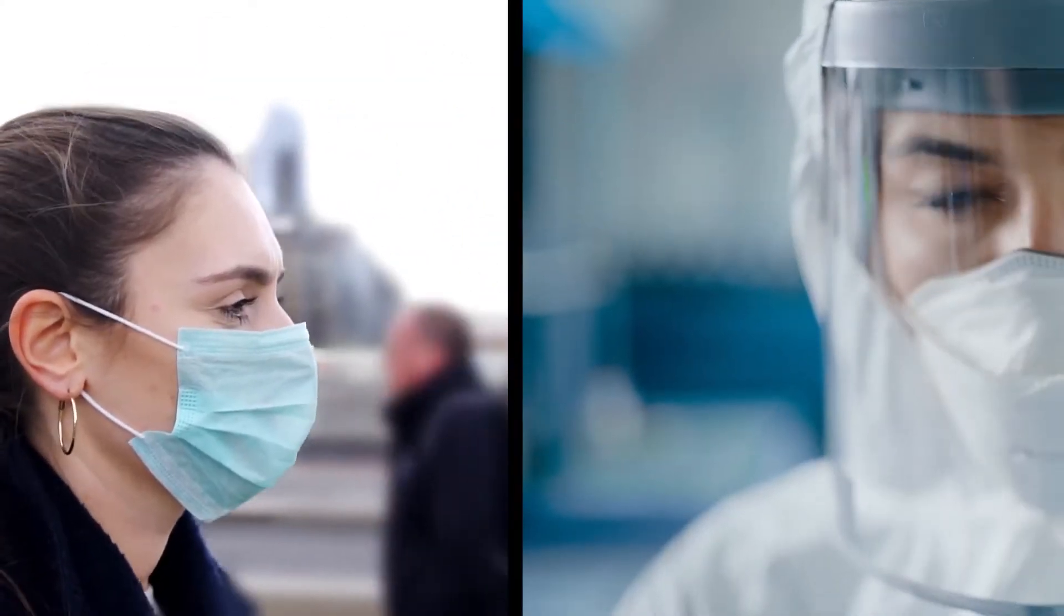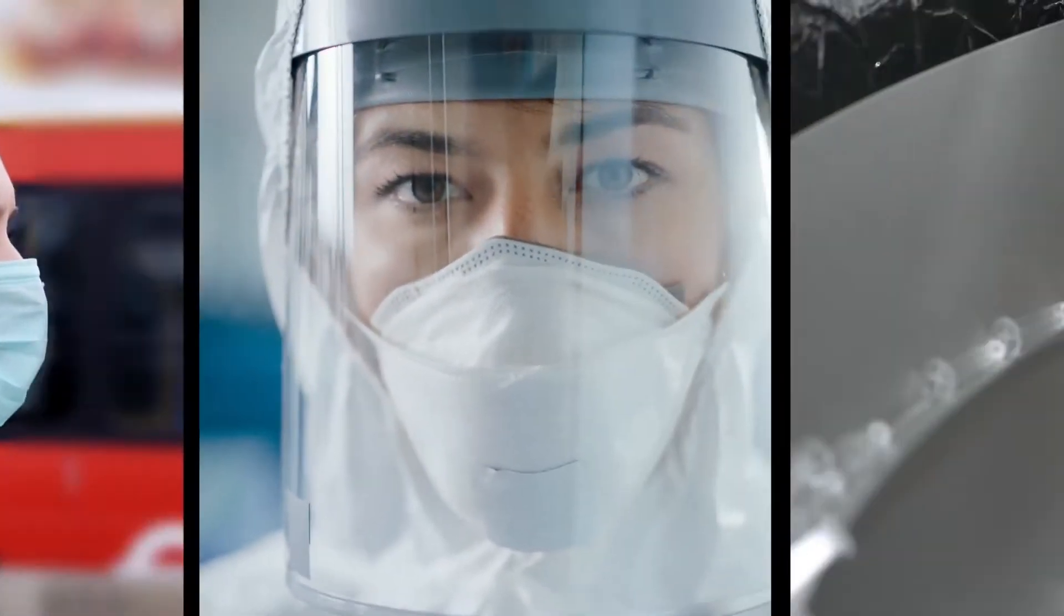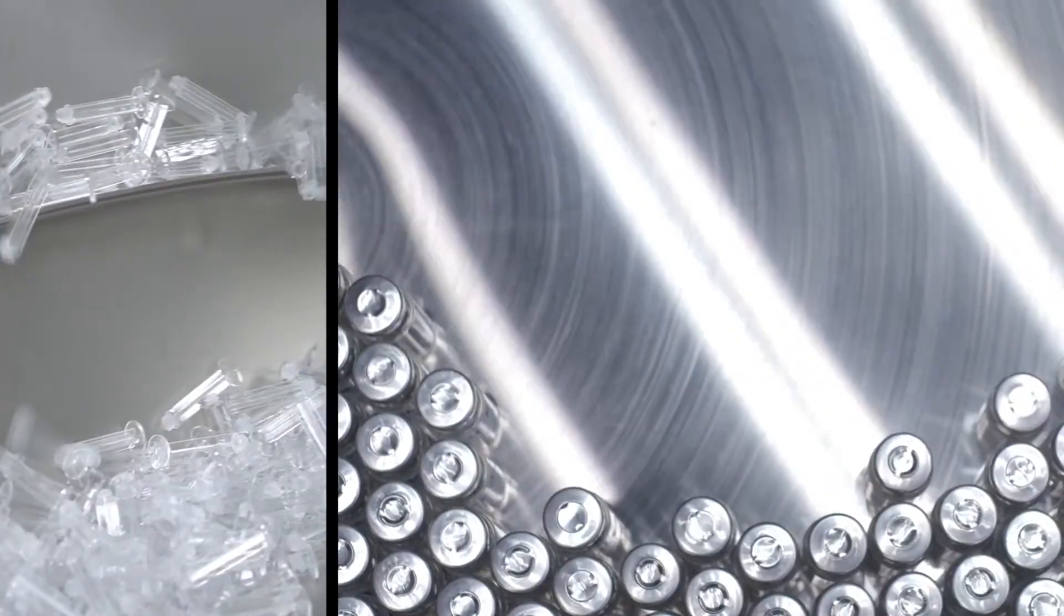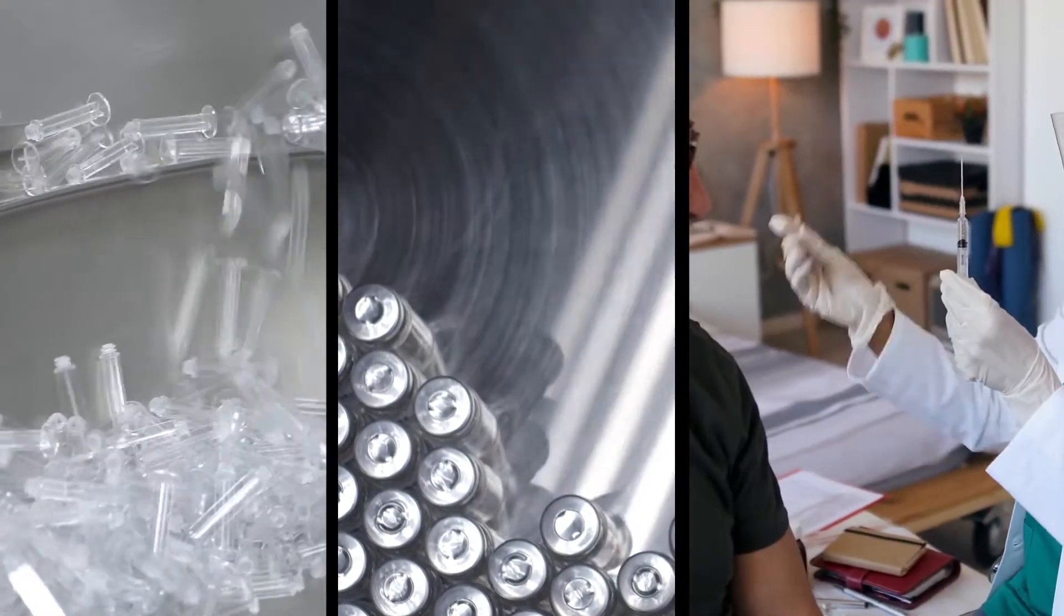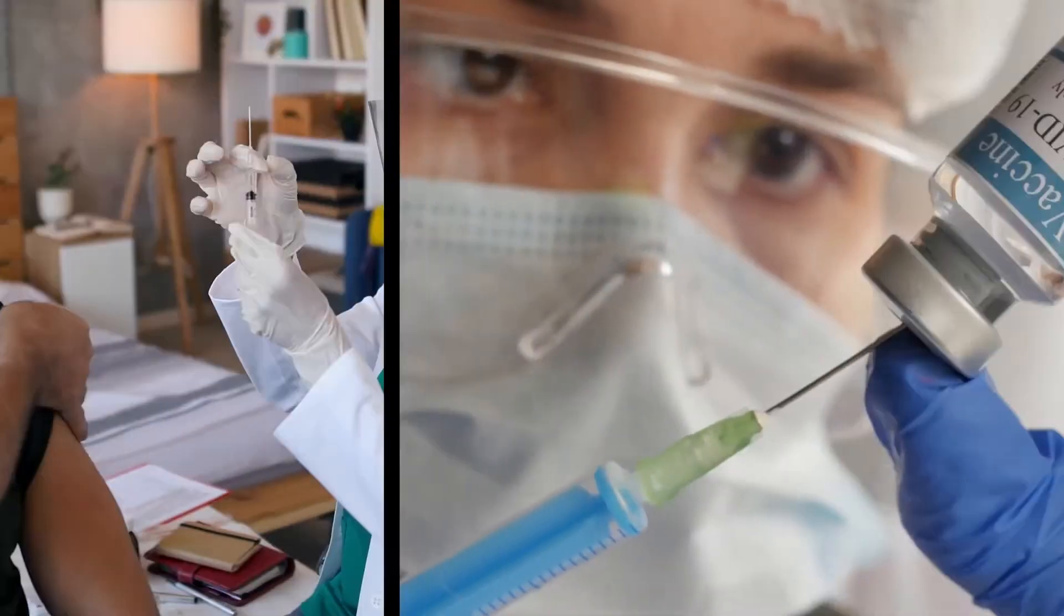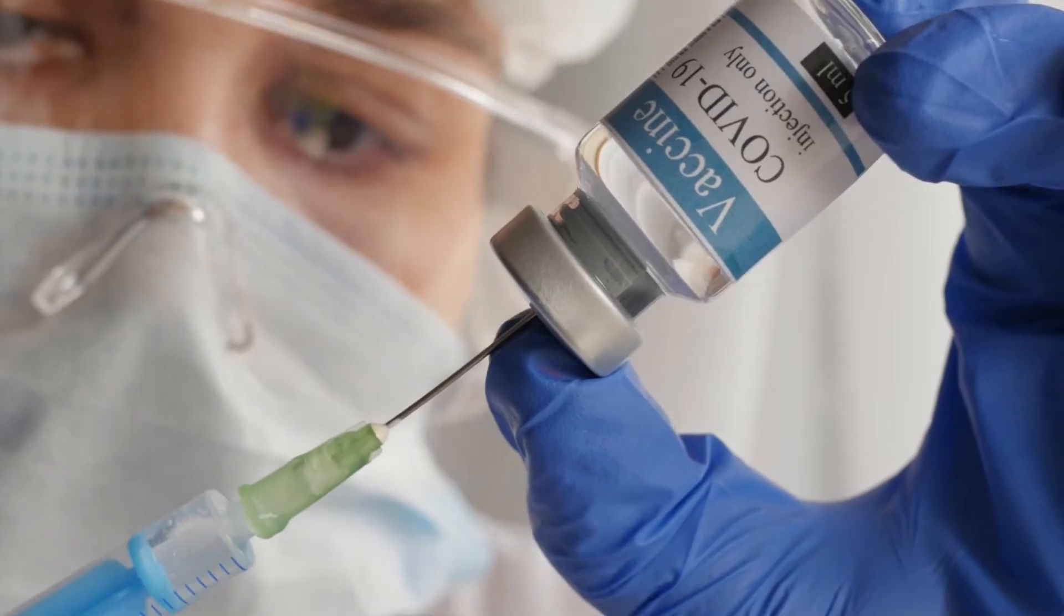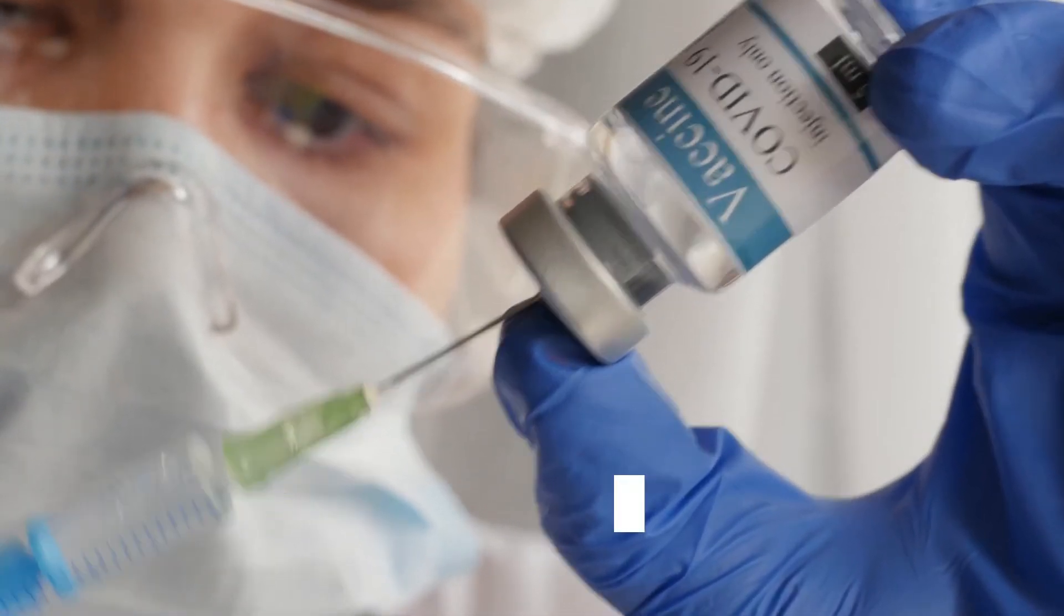The COVID-19 pandemic has placed unprecedented demand on manufacturers of syringes and vials. Pre-filled syringes containing a single dose were quickly deemed too restrictive to get the vaccine rolled out to the population at the hugely accelerated speed required.